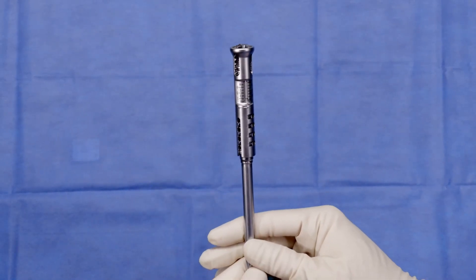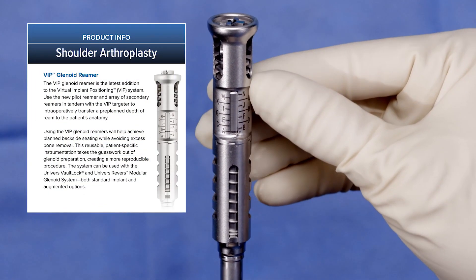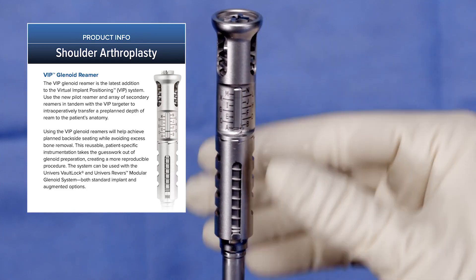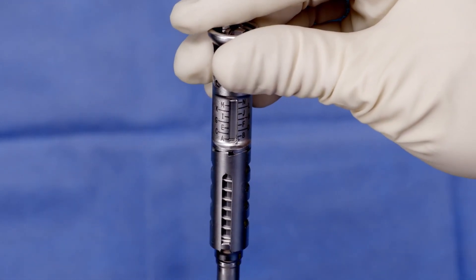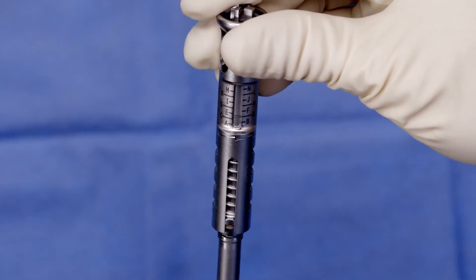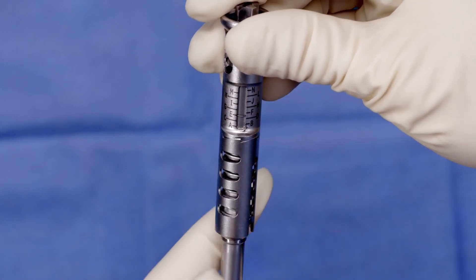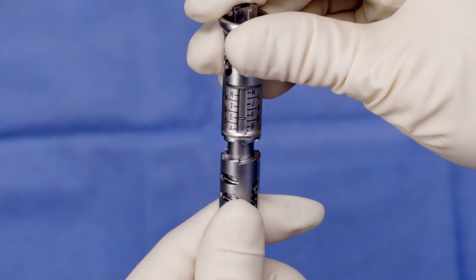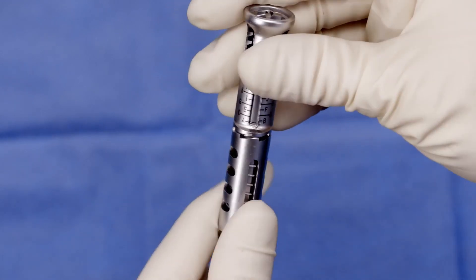I wanted to show you a little detail on the VIP pilot reamer. You'll see a series of letters on the pilot reamer and this indicates the depth of ream from your VIP plan. This can be dialed to what your VIP plan calls for simply by turning the shaft and watching the line, which will correspond to the letter from your VIP plan. If you accidentally go too far or need to reset it, you can simply pull back and spin it and then restart again back at A.